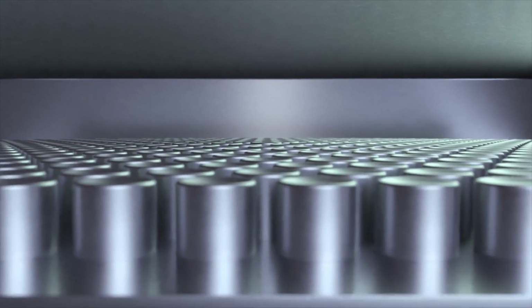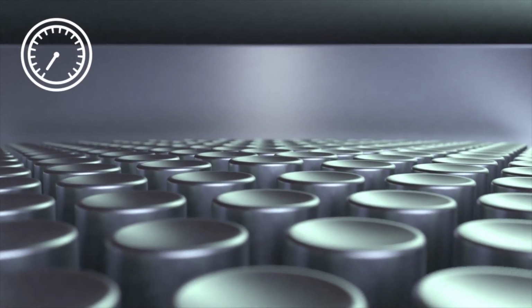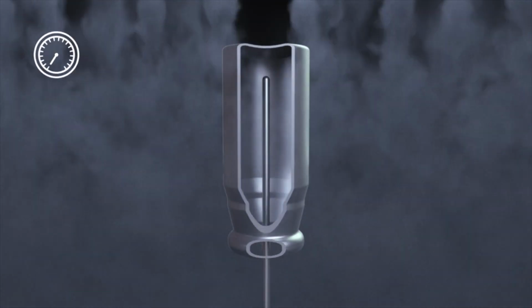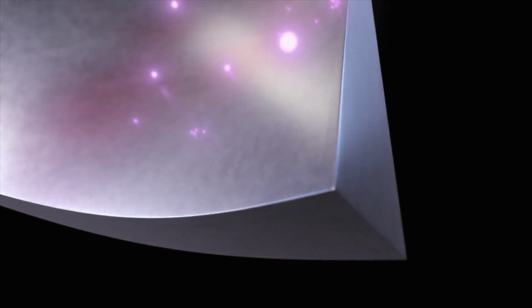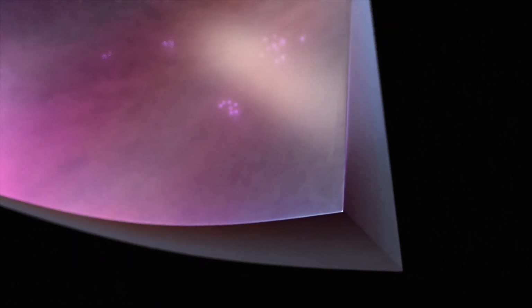The cans are placed with an electrode inside each can. Pressure in the plasma chamber is reduced to form a vacuum. Process gases are fed into the chamber. RF power is applied to the electrodes. This causes ionization, which produces the plasma. This is deposited as a nanolayer that is covalently bonded to the internal can surface only.